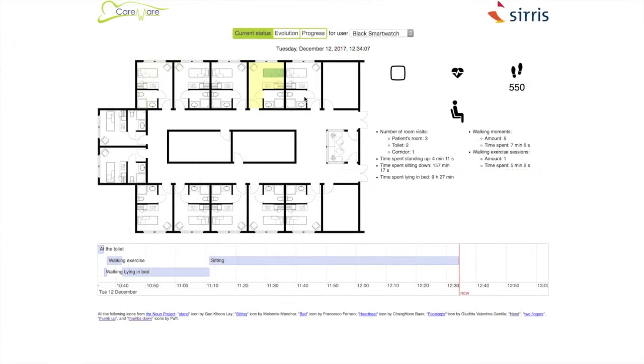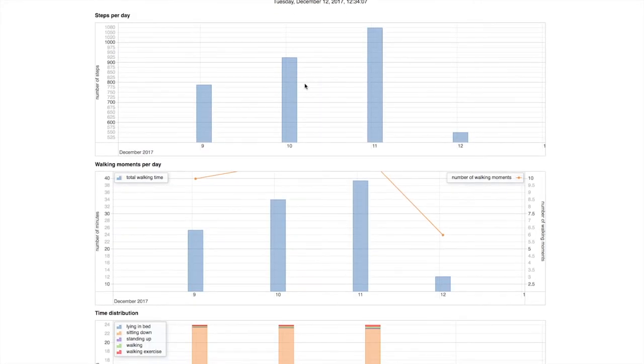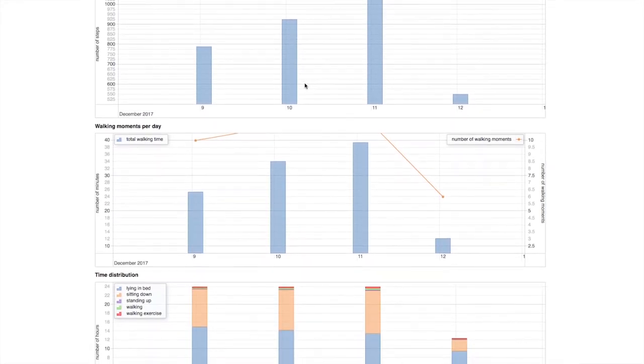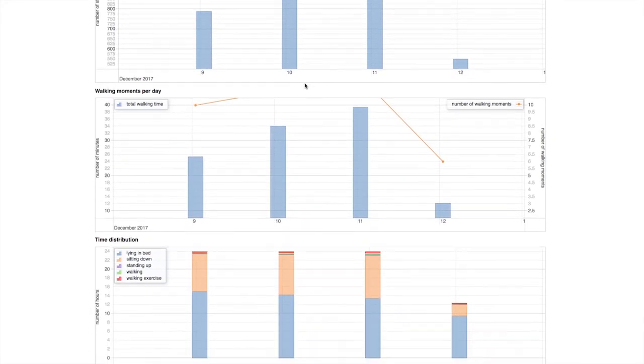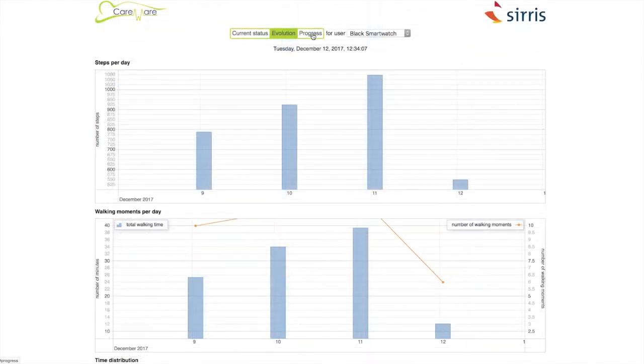Finally, in the other tabs, the dashboard also depicts information about the evolution of the patient and about his or her progress against assigned goals.